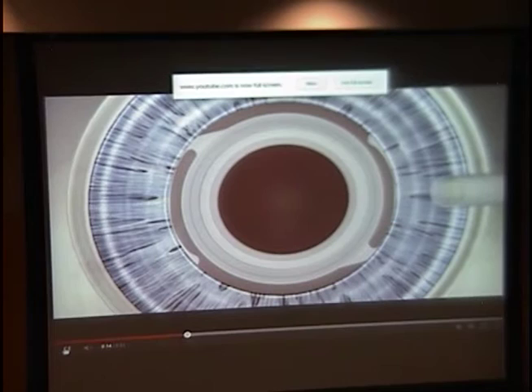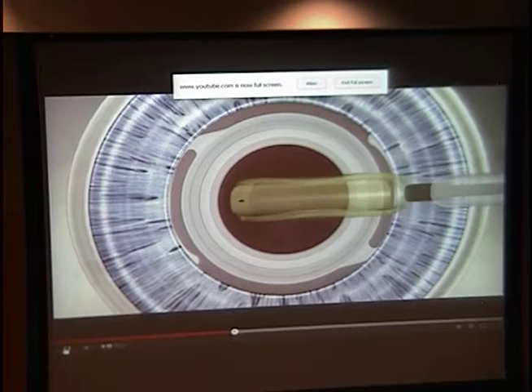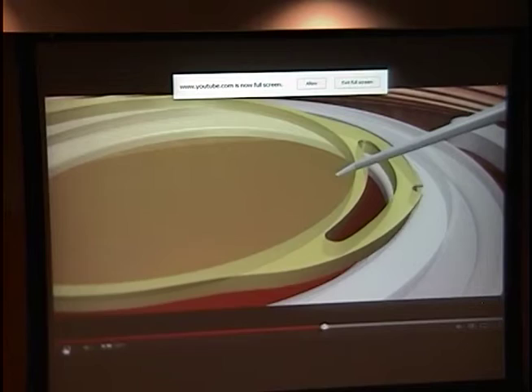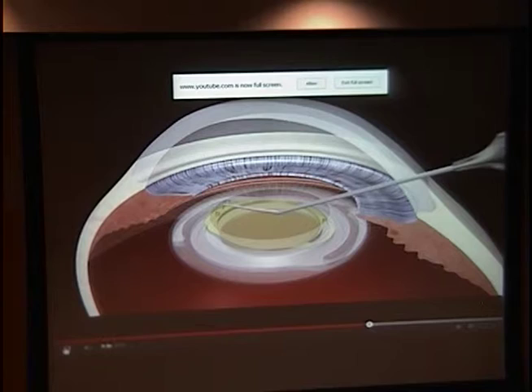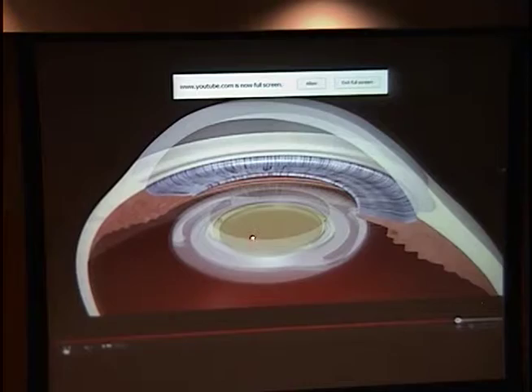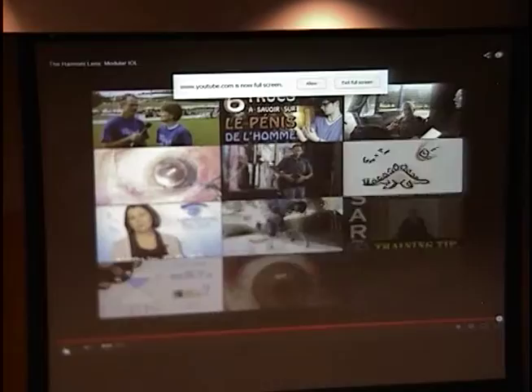And then again, a second injector with the optic piece is placed within the bag. With a little bit of manipulation, you can slide the first wing into that base piece. And then using this little manipulator hole, you can slide the second one in as well. Ideally, with two small maneuvers, you could have the optic securely in place. And that hole allows you, if you want to come back, to just slip that end out, pull this other end forward, and take the optic out while leaving the base in the bag permanently.